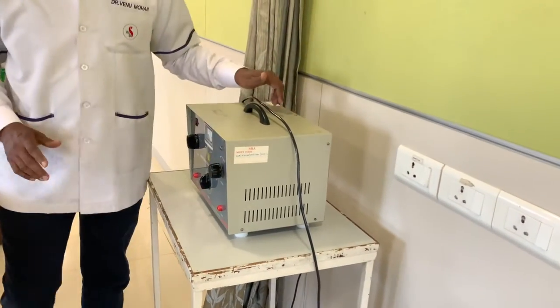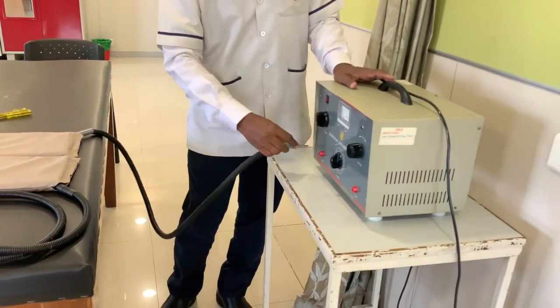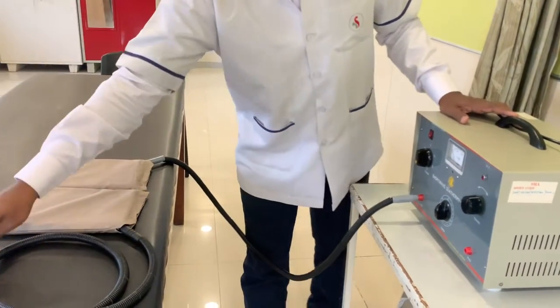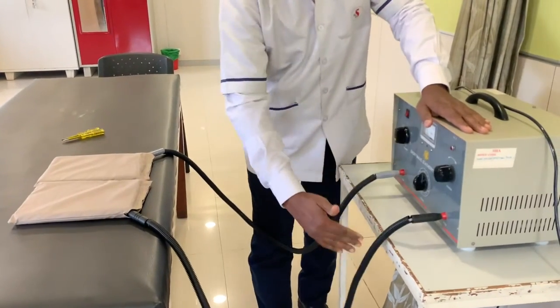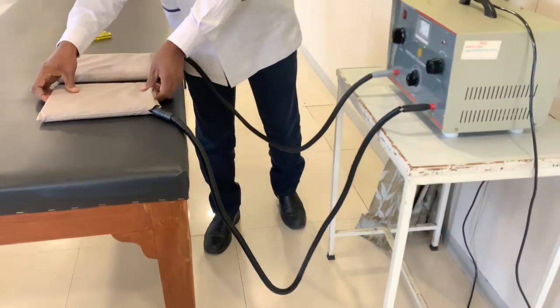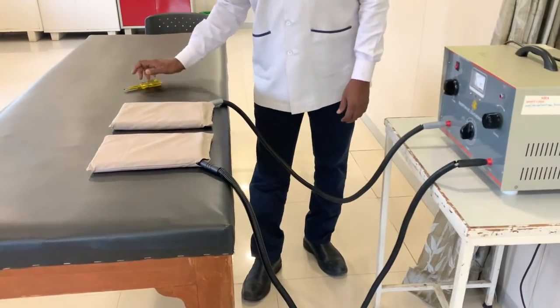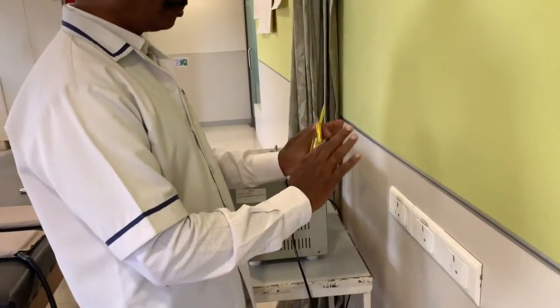So the next step is connecting the machine. When you connect the electrodes, you see that the cables are not twisted. Both the cables should be separate, they should not be closer. Both the electrodes should be placed apart, there should be some space between them. Next we'll continue with testing the power plug.